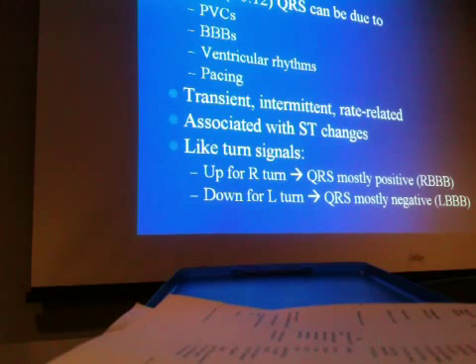And it's the QRS in lead V1 that gives us our answer whether something is a right or a left bundle. And the one thing about a right bundle you want to remember is there are two R waves. So the rabbit ears, okay? The two R waves. Now they may be tiny. Some people call it the M or the rabbit ears. It's a right bundle, all this R, okay?